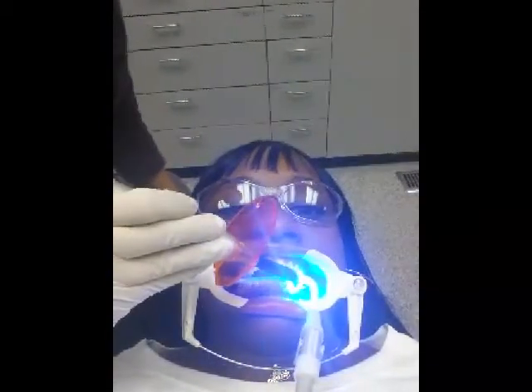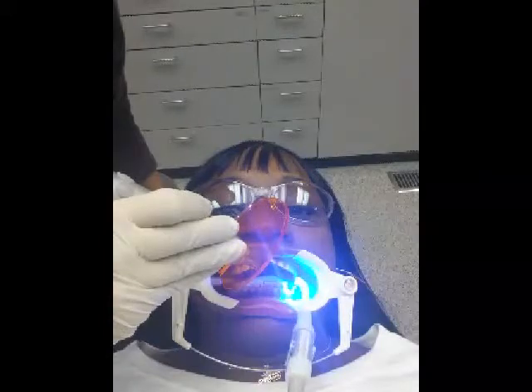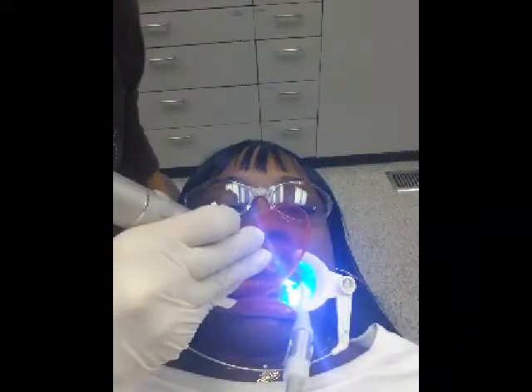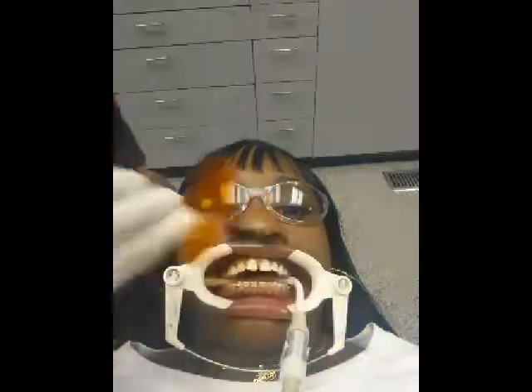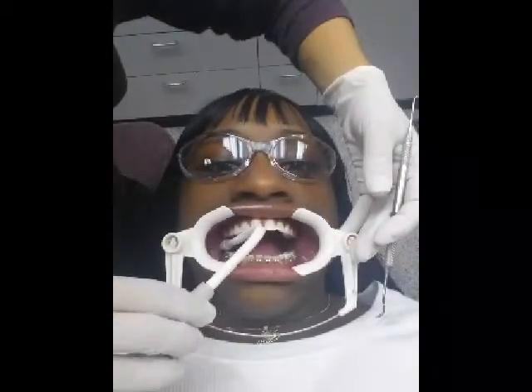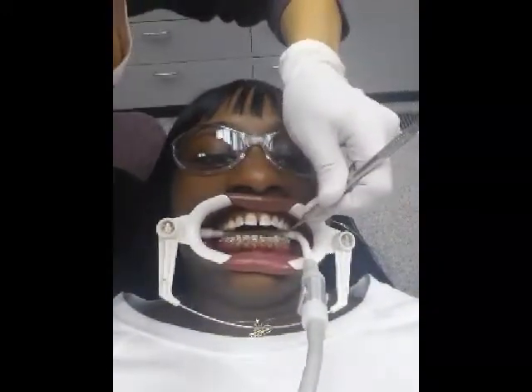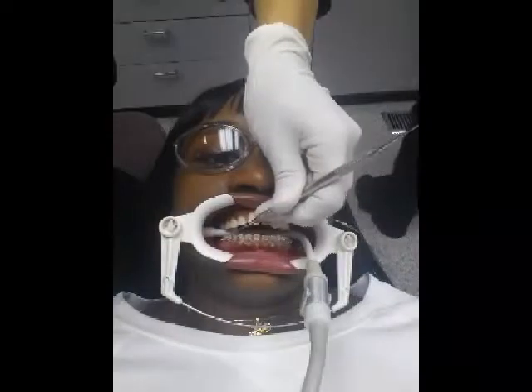Here she's using the light to dry the glue. It causes the glue to harden, and I think she has to leave it on each tooth for a period of time because it kept beeping, so maybe 10 seconds or something like that. And then after she dries each tooth, she takes the little scraper and kind of just grabs and tugs a little bit on the bracket to make sure that it is glued and hardened down and that it won't move. And she does that to each tooth.